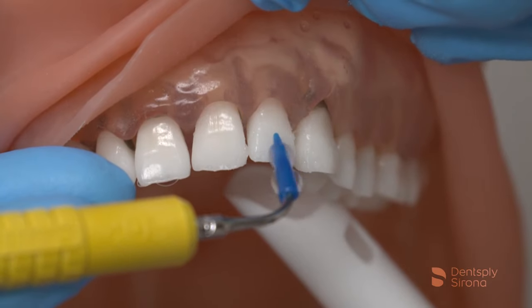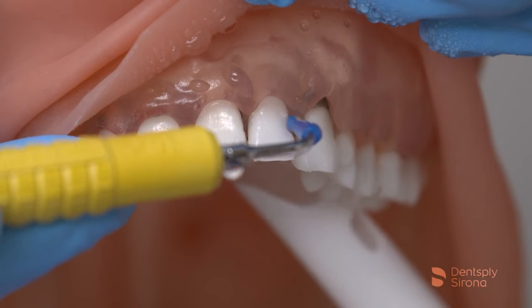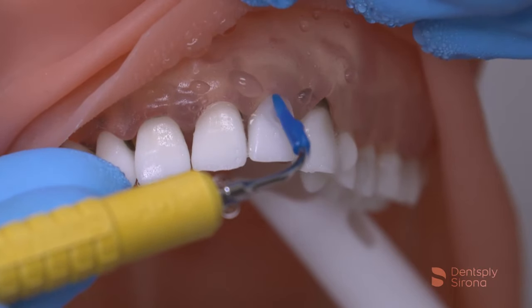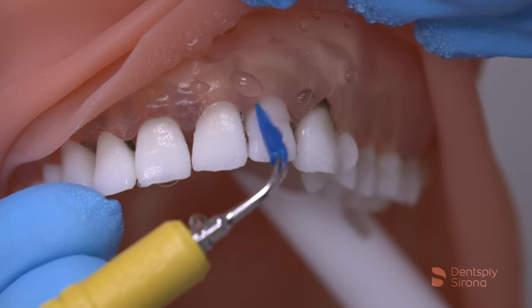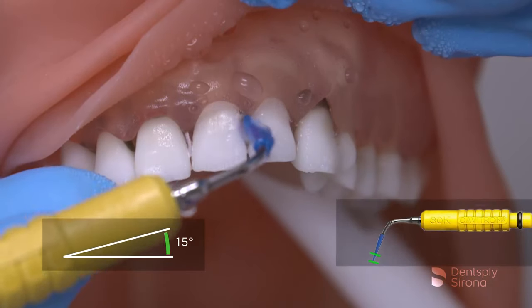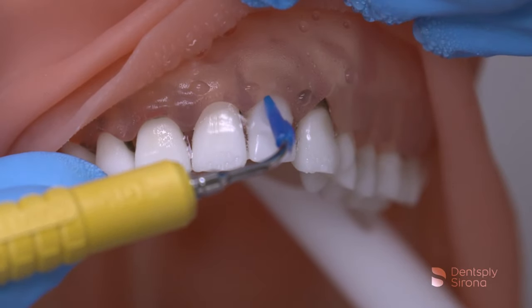Dental implants and their titanium surface need additional consideration when choosing the proper debridement instrument. The sulcular environment and the mucosal seal is more fragile than the normal tooth and this requires a gentle approach when debriding in the sulcus. The insert terminal end is placed slightly subgingivally with a 0-15 degree angulation and 2-3 mm adaptation. Utilizing a 1-2 mm overlapping stroke will ensure thorough biofilm debridement.